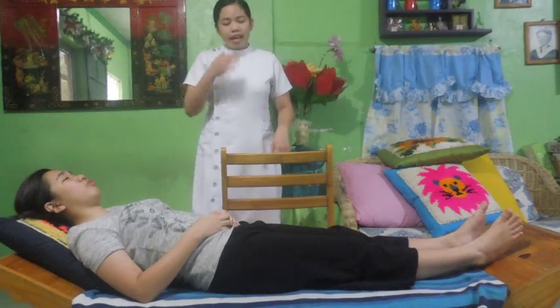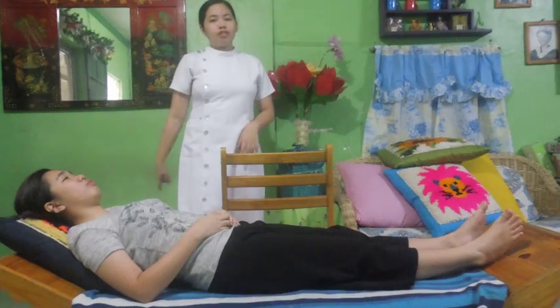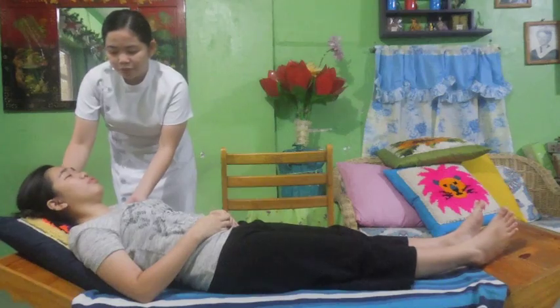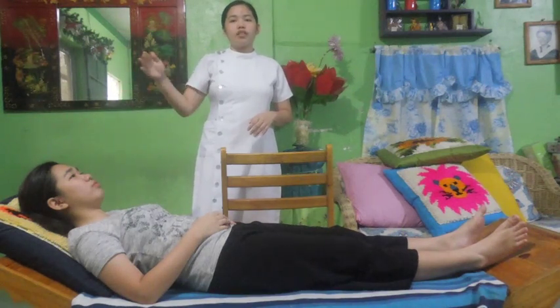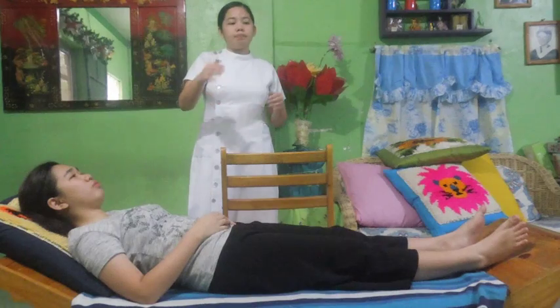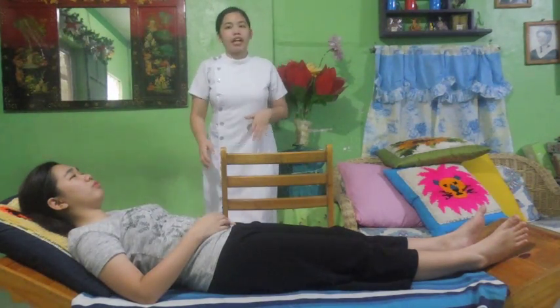So assume that there is a side rail, and you need to remove all the pillows and put one pillow against the head of the bed. Assume that there is a pillow on the head of the patient. If your patient can move without assistance, encourage them to grab the side rails, bend their knees, push off, and pull up by their arms.